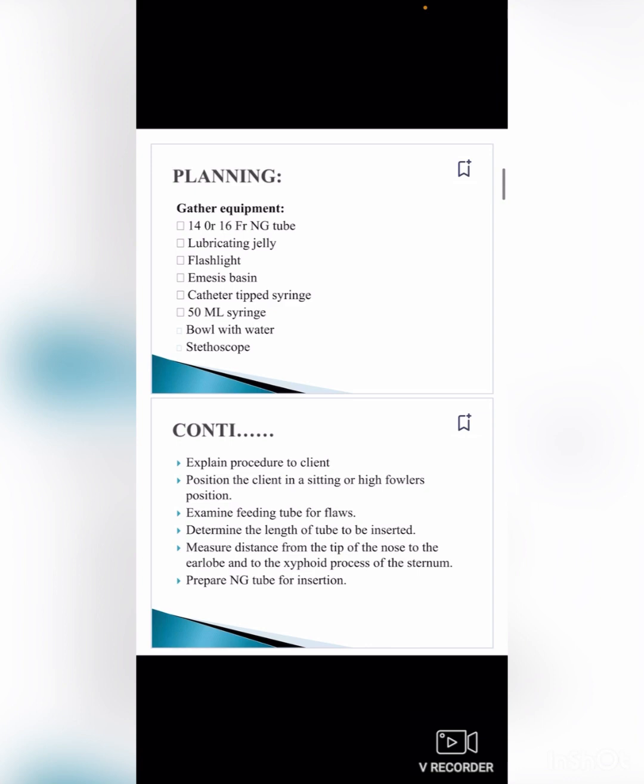Position the client in a sitting or high Fowler's position. Examine the feeding tube for flaws. Determine the length of tube to be inserted by measuring the distance from the tip of the nose to the earlobe and then to the xiphoid process of the sternum. Prepare the NG tube for insertion.